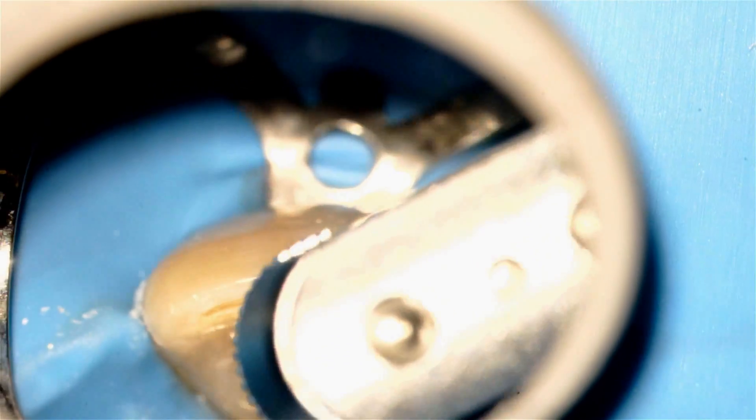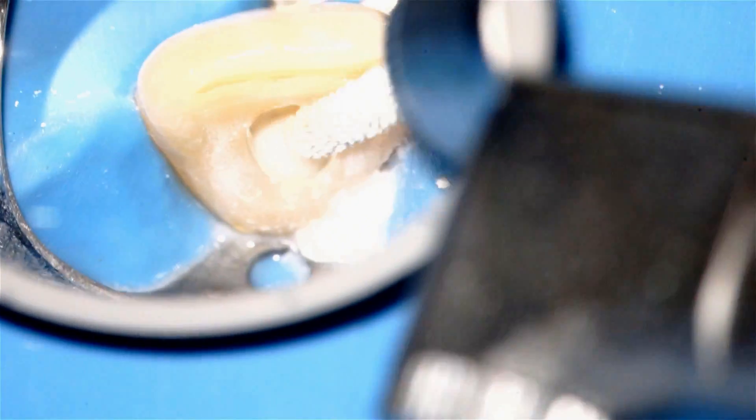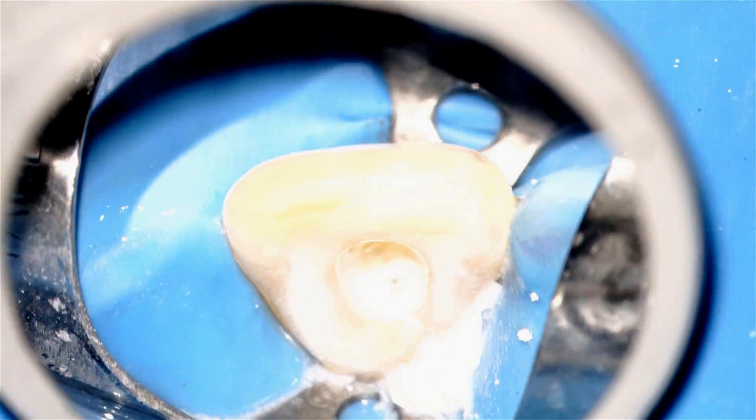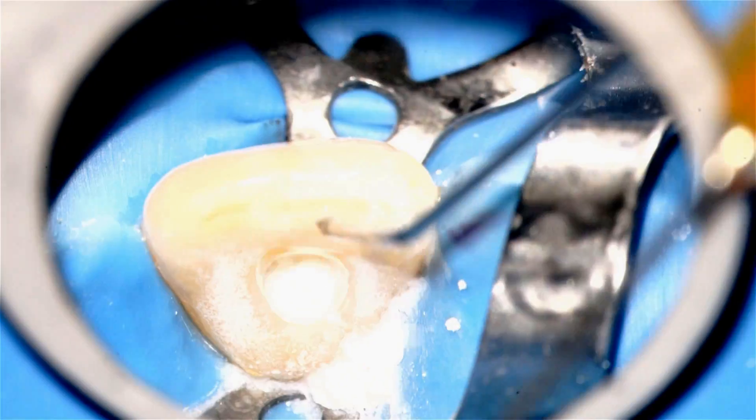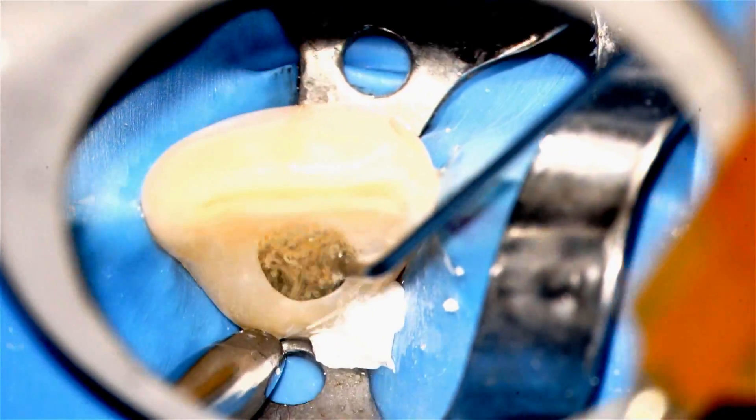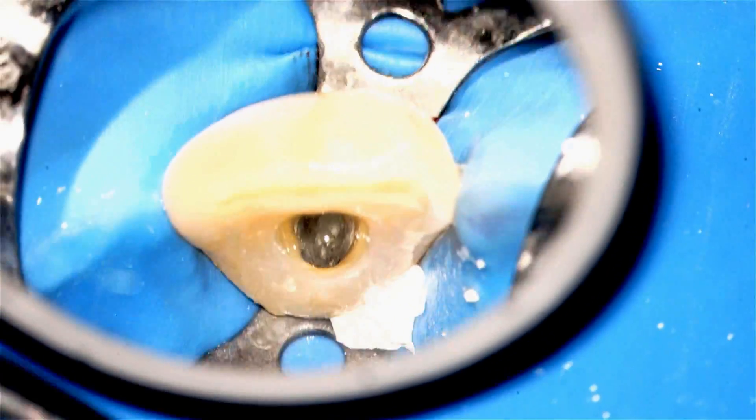So here I place some water and I use a Versabrush made by Vista, spin it around to get the Cavett off the walls and just keep it clean, taking great care not to press it and to push any Cavett into the lingual and distal lingual resorption defect.